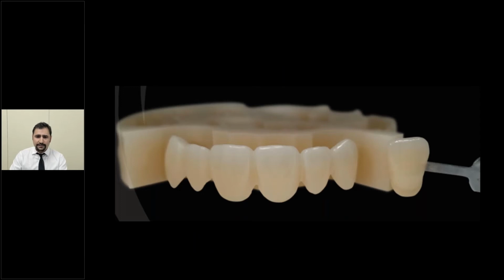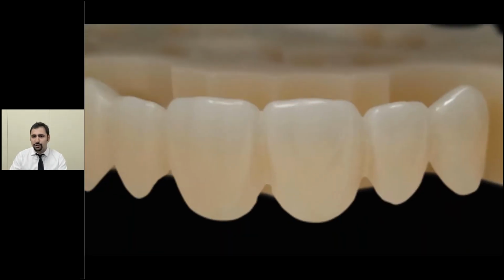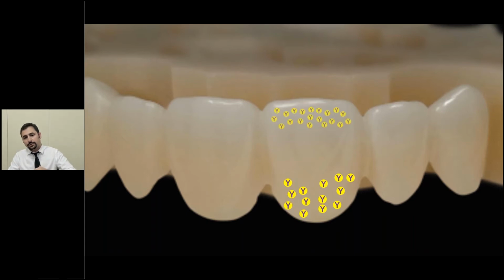Now, when we look at Zirlux Transition, it has its unique technology that creates these changes and variation between the cervical region and the incisal region. So in the cervical region, we would have less amount of yttria in comparison to the incisal part, which usually needs higher translucency. So that's why as we go gradiently, it moves toward a different amount of yttria. That's why also in the instructions for use, it was mentioned more than 7%.